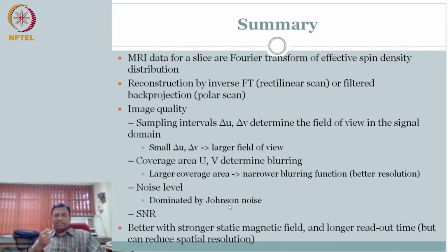Quickly, if it is X-ray CT, I know it's supposed to be related to X-ray attenuation, the material's attenuation property for the X-ray coming at that particular energy. That is the fundamental signal. Then of course you convert to Hounsfield units, so the X-ray CT image has Hounsfield units. Likewise in ultrasound, we send sound, you receive sound.